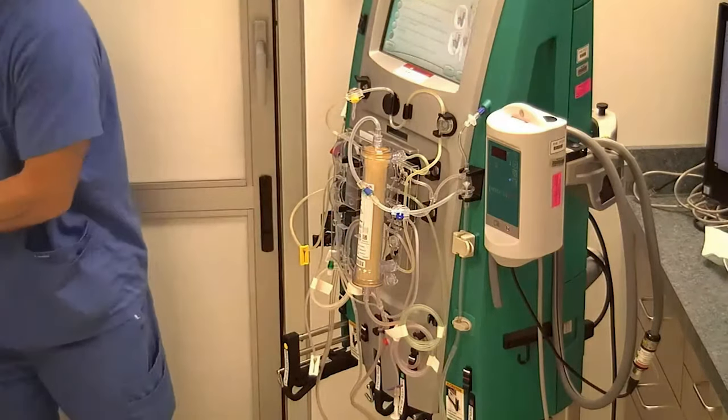I'm going to now hit PBP for our pre-blood pump. And for training purposes, we're just going to say that's around 100. Typically, we'll see anywhere from 500 mLs to 1500 or 2000 mLs.